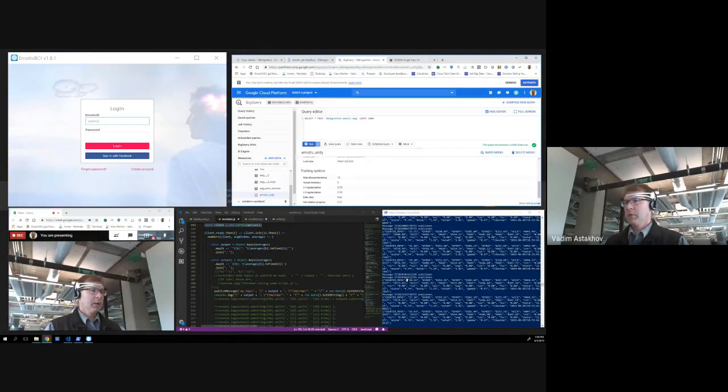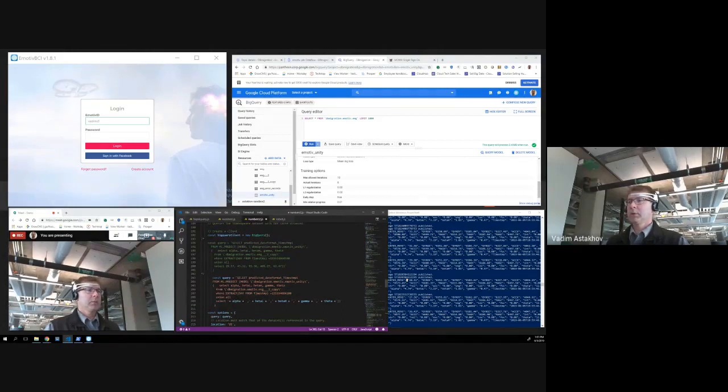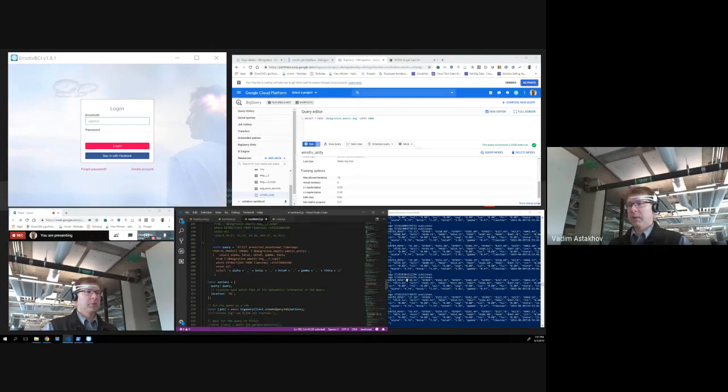So I have another script that queries this model. I use a BigQuery client, and within this BigQuery client, I formulate the query and send it to the BQML model, and I get the prediction value back. Based on the trained BQML model, it tells me what I'm thinking of. Am I thinking of pushing my mouse left or right, and so on.